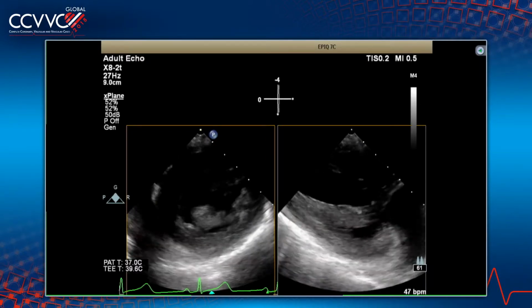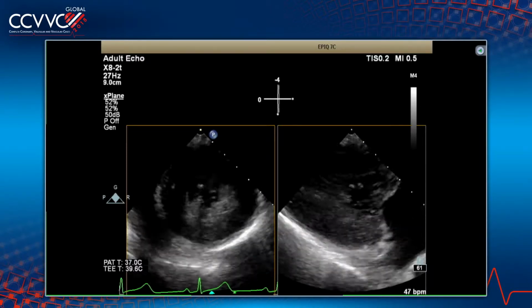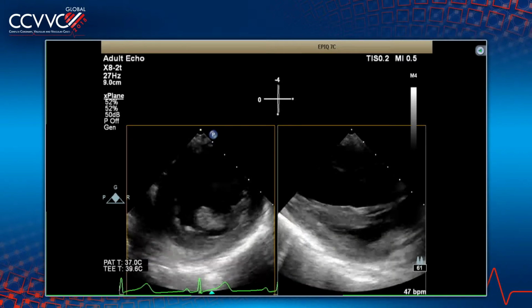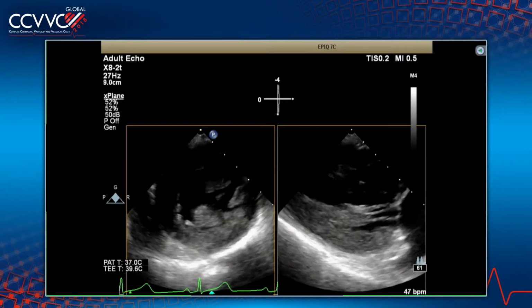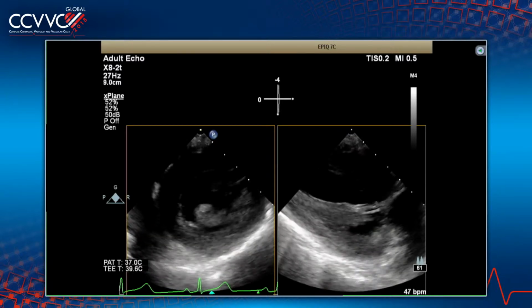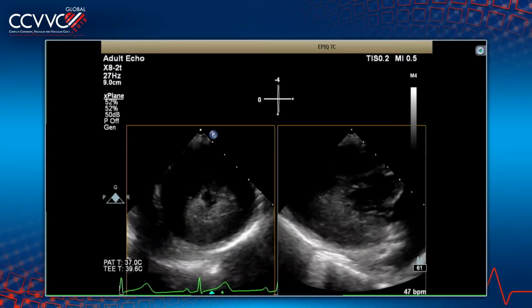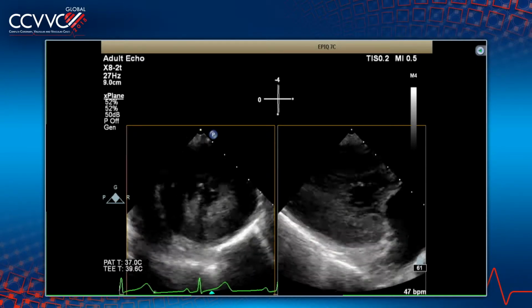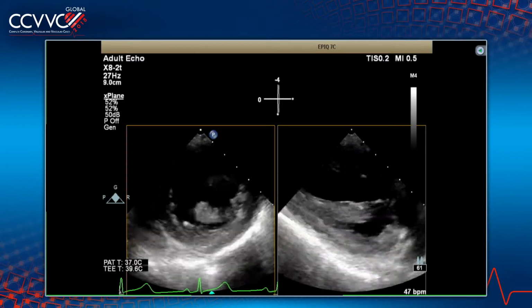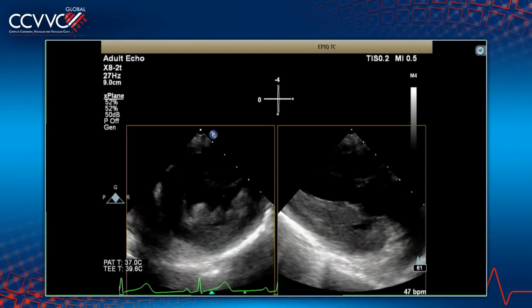So I see that you have Jason Kovacic. Jason, you want to take us through the echo and how you are prepared? We have Gila Perk, who is the echocardiographer at the head end, and then we have Minakam, who is the anesthesia. We actually have MAC anesthesia right now. Okay, Gila, if you can show us the echo and go through it.